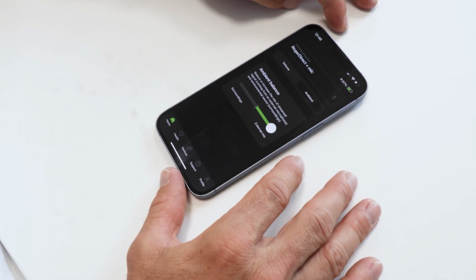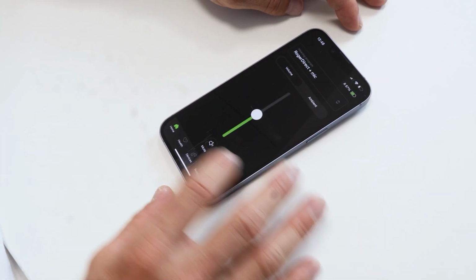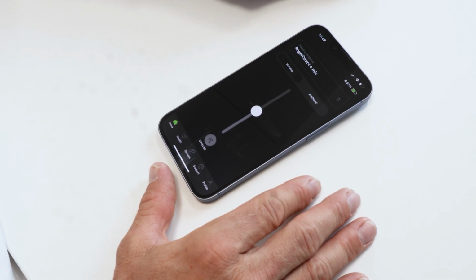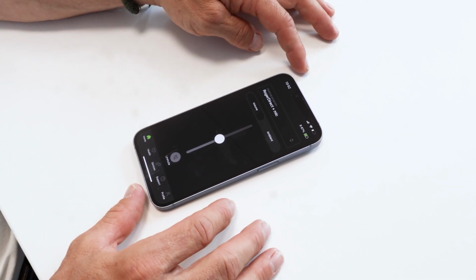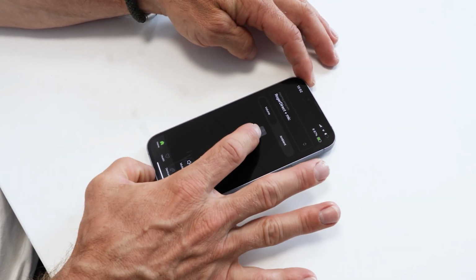If you would like to completely mute the hearing aids, then go back to volume and click on mute. This way no sound will be picked up by the hearing aid anymore and you can fully concentrate on the Roger signal. On this screen, you can also adjust the overall volumes for both signals, like this.